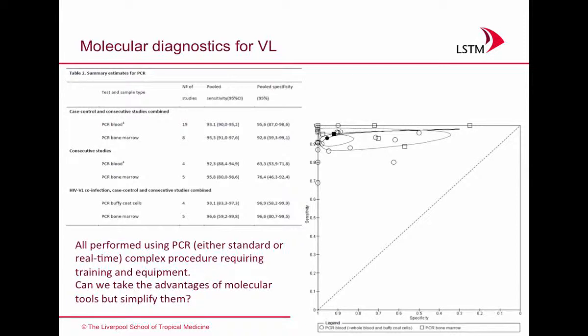So that's where we are with the molecular tools for VL, but they do show promise. They are of high sensitivity, and maybe it's possible that some of these studies, there are very few studies, only 4, so maybe they haven't performed as well as they should.